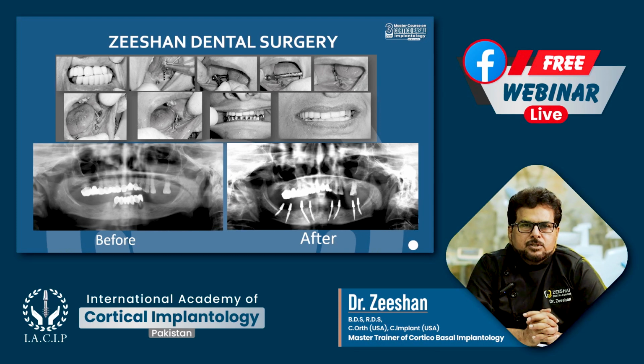So the limitations of conventional implants can be overcome with the help of thin, long basal implants, and they can be placed at an angle to increase the length.